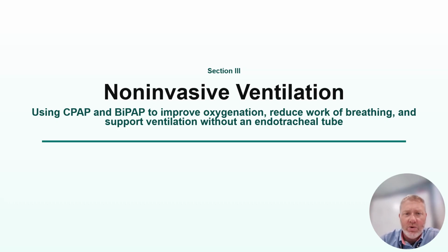So if you and I have an intrinsic PEEP of 3 or 4, and we put a patient on a high flow nasal cannula of 60 liters per minute, you might get 4 or 5 for PEEP, but that's not something that you can monitor or measure.